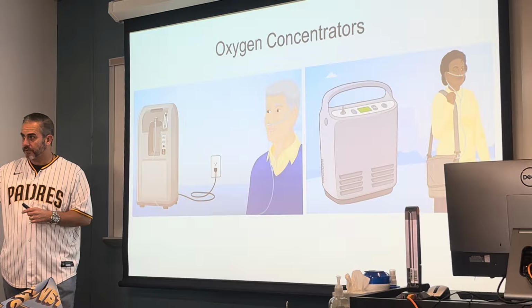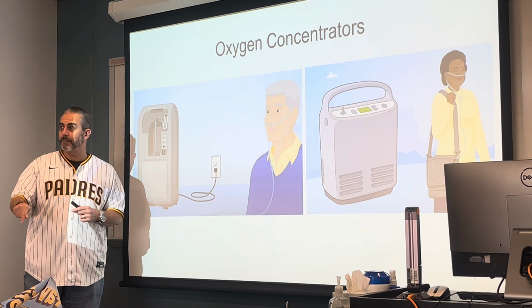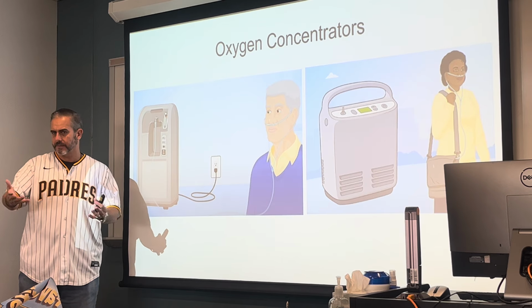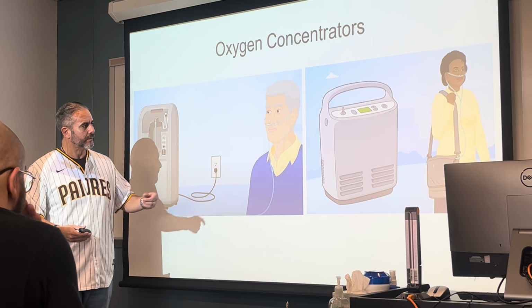And so if you're going to a doctor's appointment and then planning on going shopping and then having lunch, that tank might not last long enough for you for this one trip, so you maybe need a second tank. Now tanks, they're heavy, there's some weight to them.